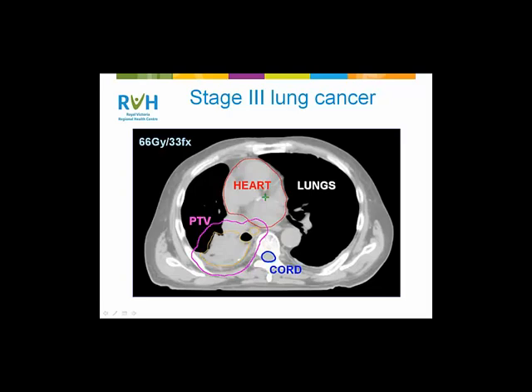And there's growing clinical evidence that irradiating large amounts of lung with low dose is something that we need to be very concerned about. So when you take a look, this is no easy presentation that we're left to deal with. So how can we approach it?